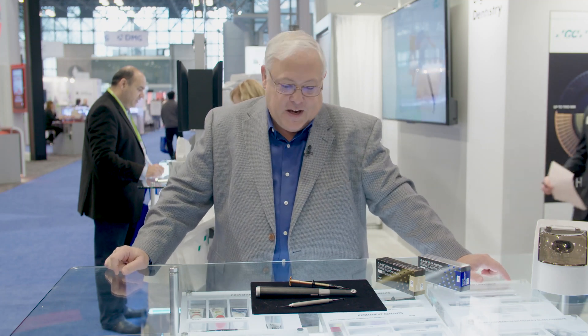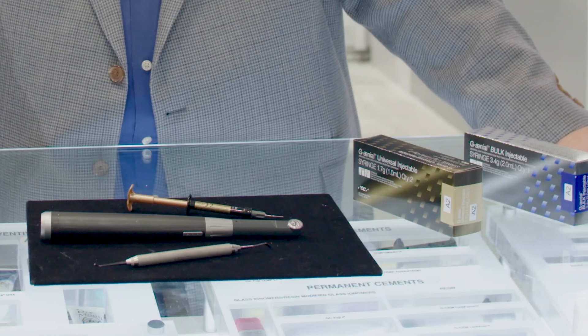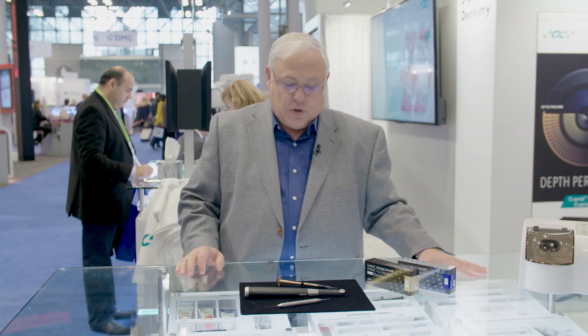I'm here today to share some interesting news and information about a new product called Genial Universal Injectable and also Genial Bulk Injectable. These two new products were launched by GC in early October of this year and will add to your armamentarium for restorative dentistry.